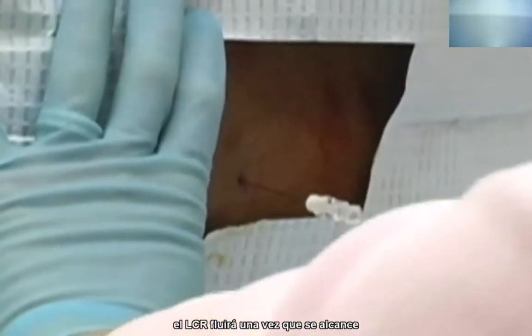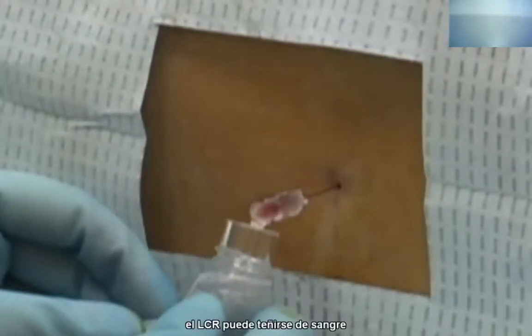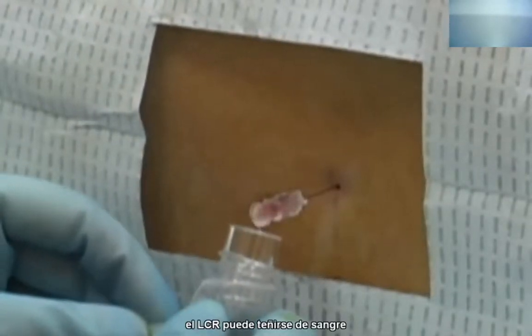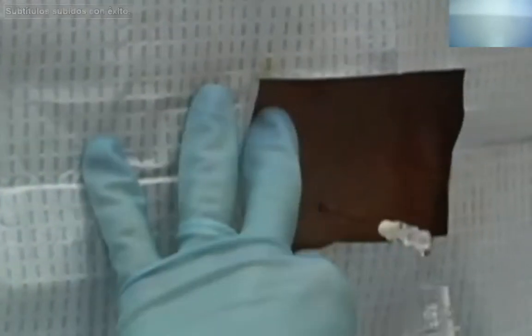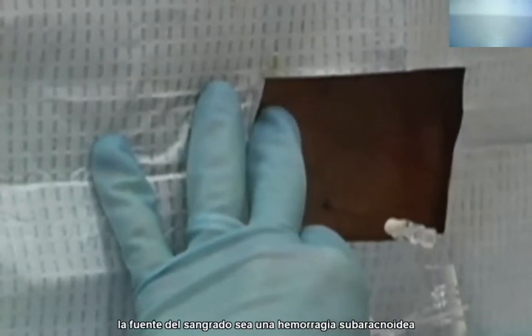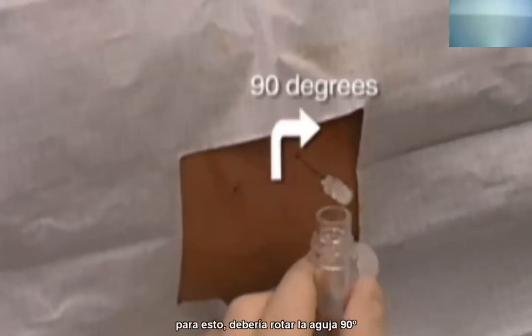Fluid will flow once the needle enters the subarachnoid space. If the lumbar puncture is traumatic, the cerebrospinal fluid may be tinged with blood. As additional fluid accumulates in the barrel, the fluid should become clear unless the source of the blood is a subarachnoid hemorrhage. If the flow is poor, a nerve root may be obstructing the opening of the needle, and you should rotate the needle 90 degrees.